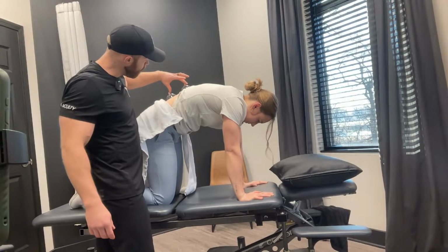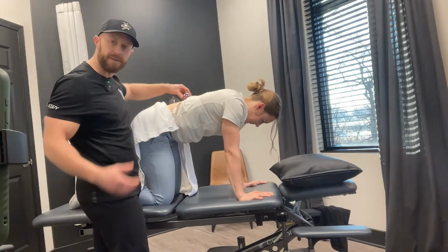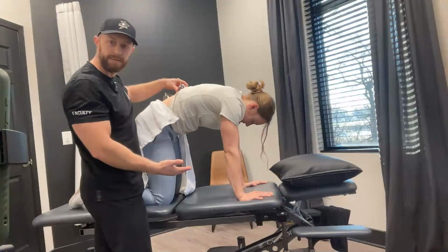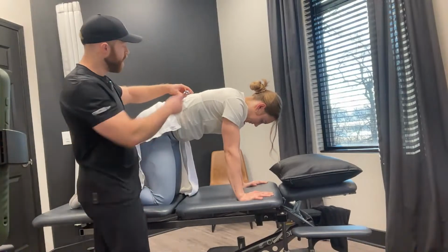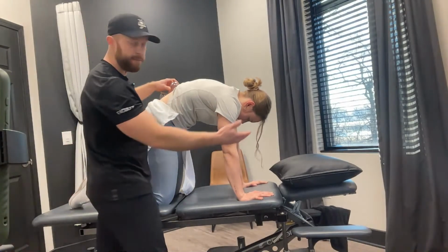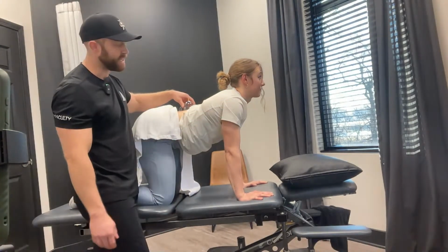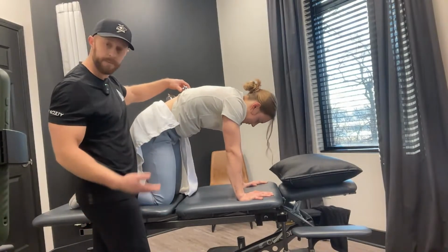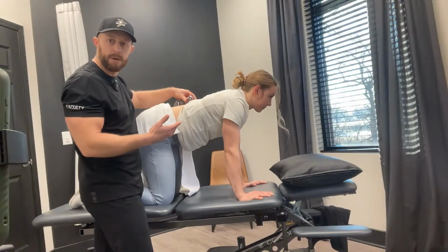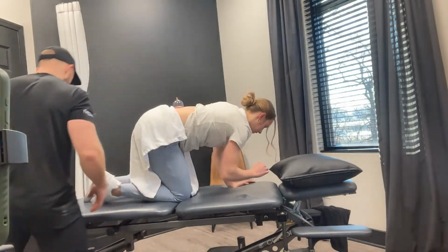So I'm going to cue them up into some spinal flexion, telling them to separate the cups. They do have a tendency to pop off, so you want to keep that gun handy. But I'm essentially just going to cue her through 10, 15 reps here of angry cats, thinking about really elongating this whole erector. If you want to make it a little bit more vigorous, you can have them gently flex their cervical spine as they go into the cat position. That's going to give you even more stretch across the erectors and often feel pretty tight for the person, but quite good. Once we're done with that, I'm going to have them just lay back down and sideline in the original position.